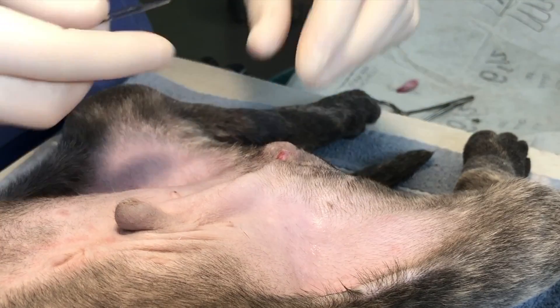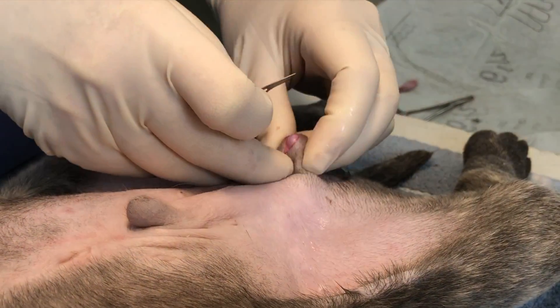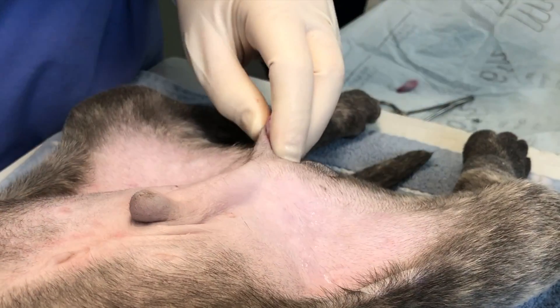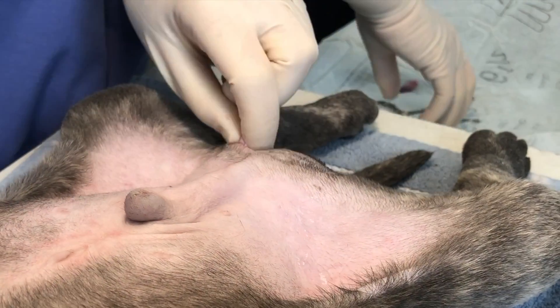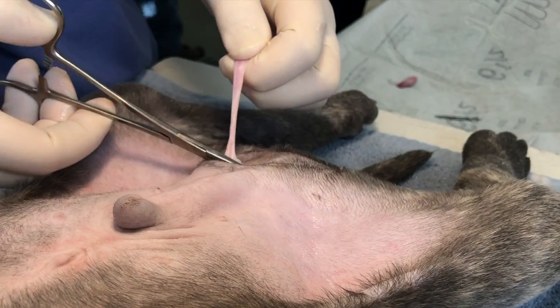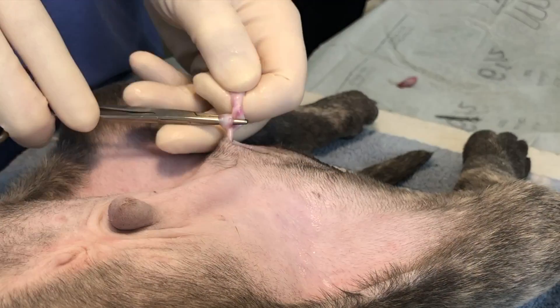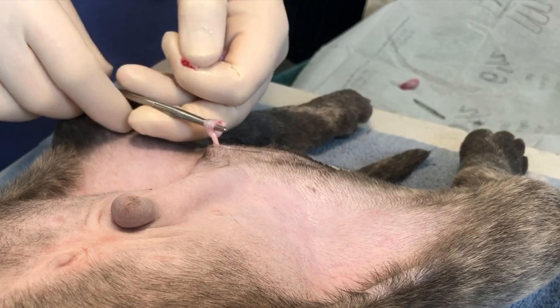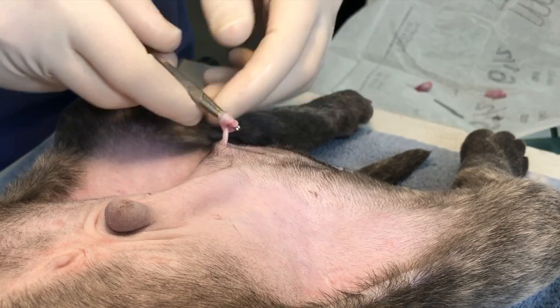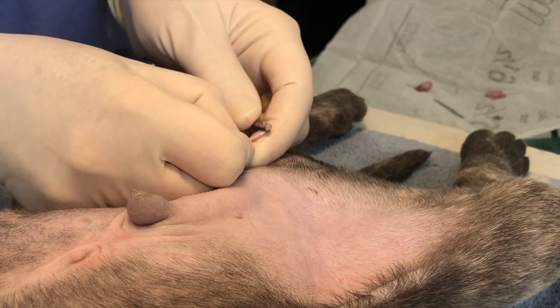A second incision is made through the median raphae, and the second testicle is exteriorized. Fat is stripped away from the cord. Once again, the cord is auto ligated using a hemostat. Once the knot is formed, a blade is used to cut between the hemostat and the testicle, removing the testicle and allowing for the knot to be completed. The knot is secured and inspected and released into the abdomen.